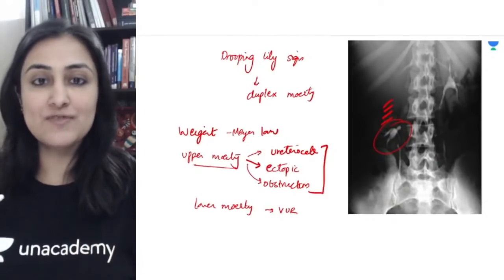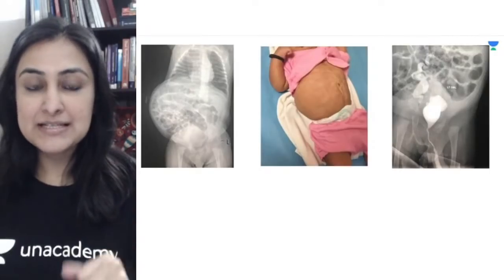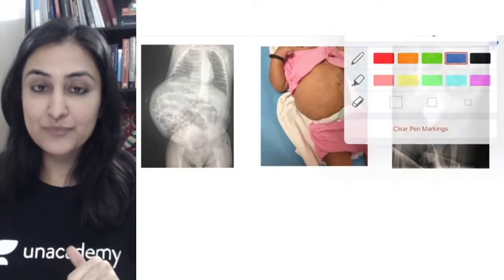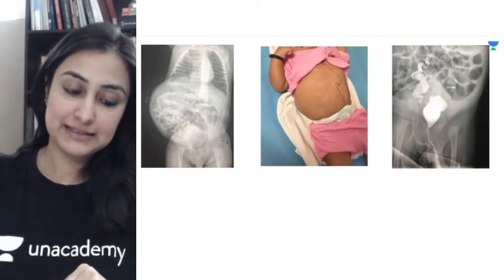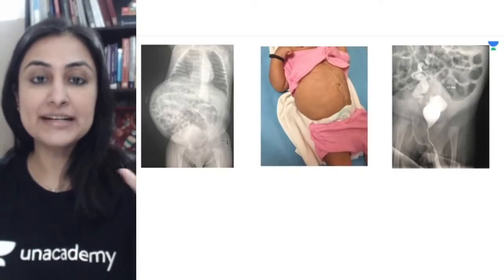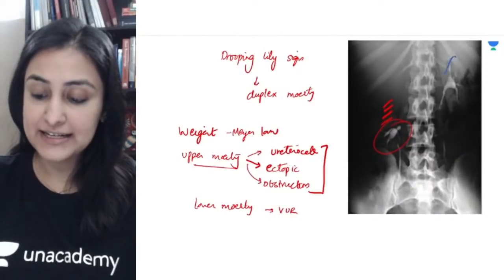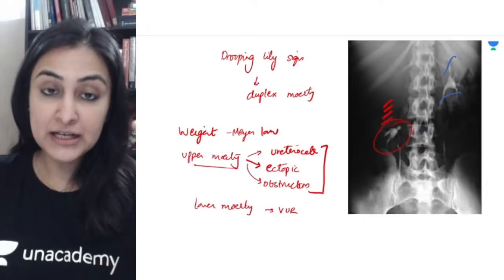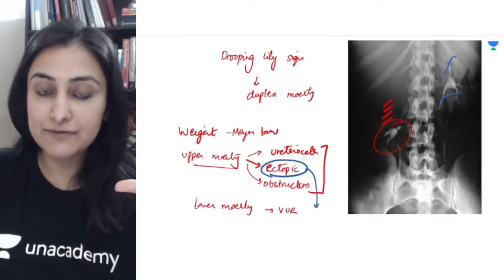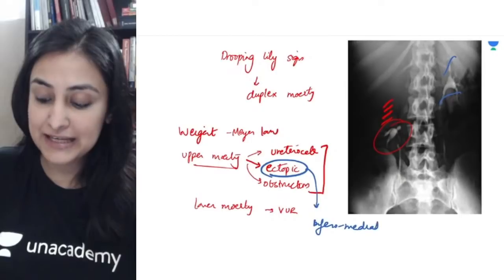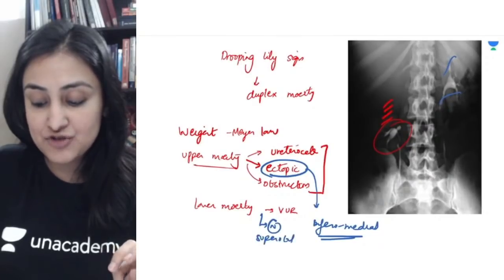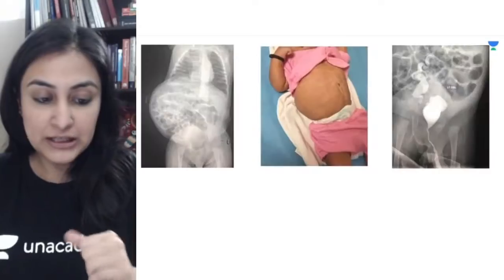This is the whole explanation of the drooping lily — very very important. Moving to the next image cluster: these are both duplicated collecting systems of the kidney. The ectopic insertion of the upper moiety — vowels sticking together — will be inferomedial to the trigone, whereas the lower moiety inserts normally, superolateral to the upper moiety.